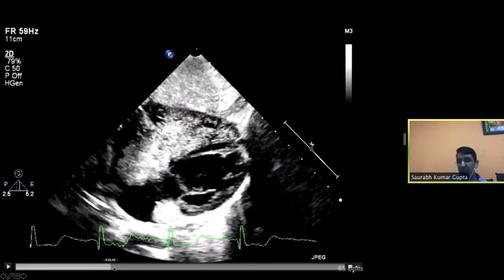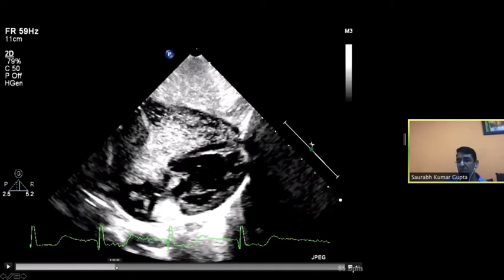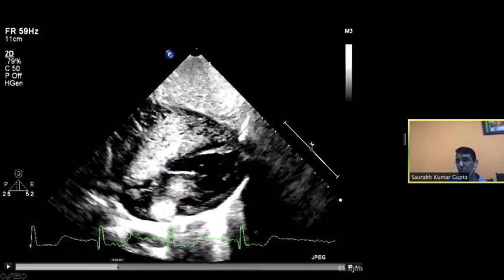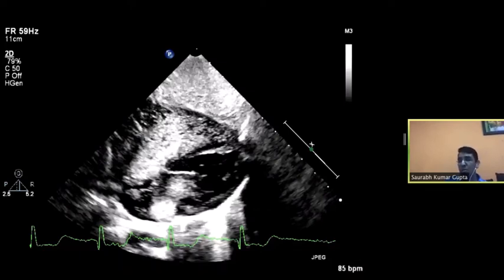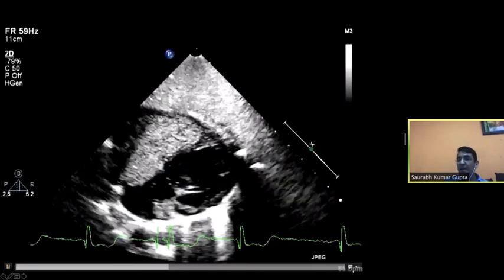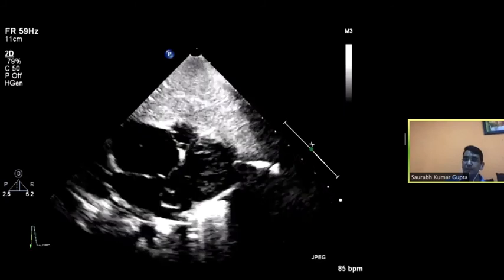But then look at this. This contrast from the coronary sinus gets into the left ventricle. And that is the importance of playing it slow with intention to reach a conclusion. And this is also to emphasize the importance of setting your echo for acquisition of more than 10 to 15 beats, or at least 2 to 3 seconds. Otherwise, you would have missed it. So this is to highlight why it is important to do saline contrast echo the way it is advised.